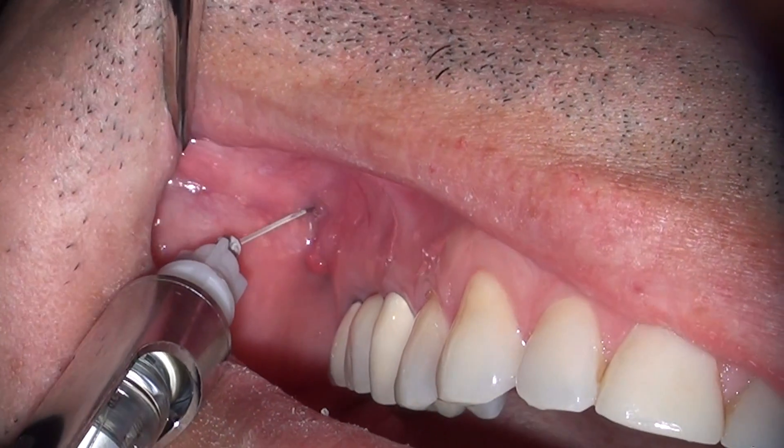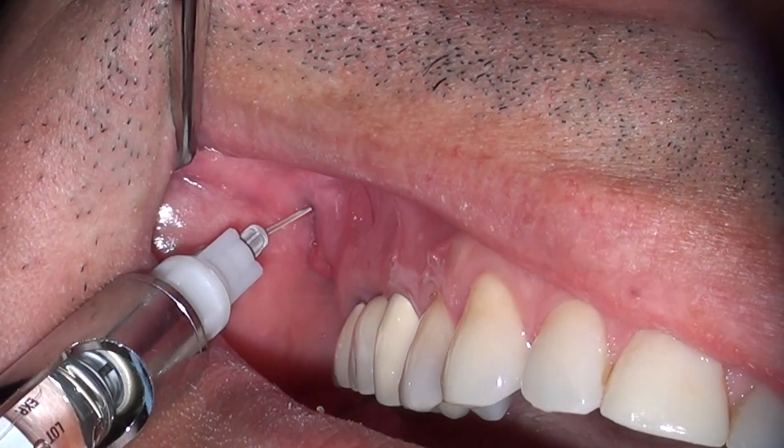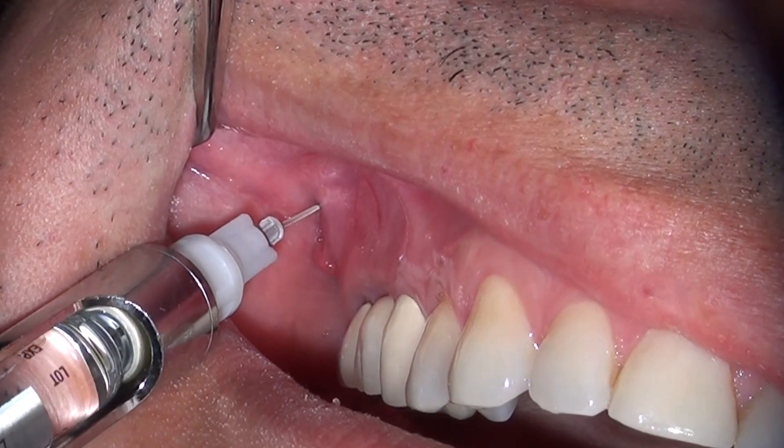The PSA block is really a predictable method of achieving profound anesthesia painlessly. I've done over 22,000 root canals and I've never had to give the palatal shot to my patients for maxillary molars. I know from experience that you really don't need to give it.